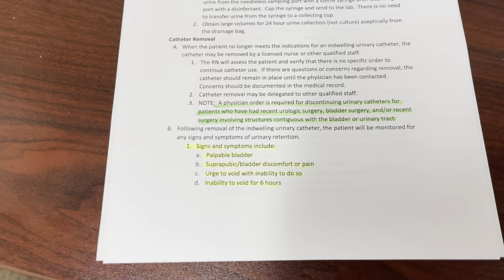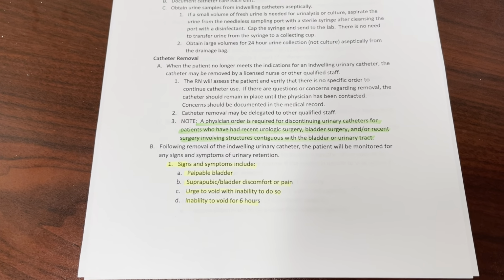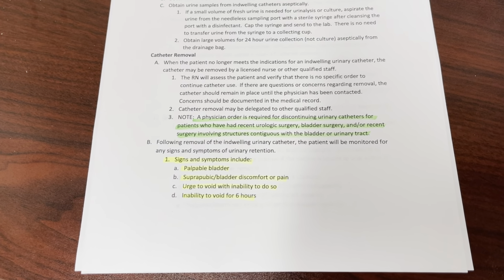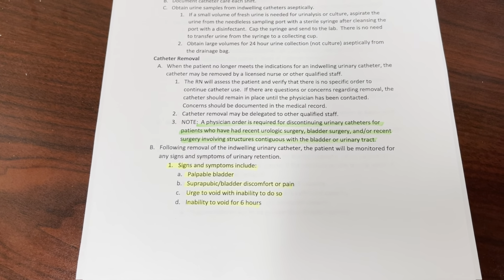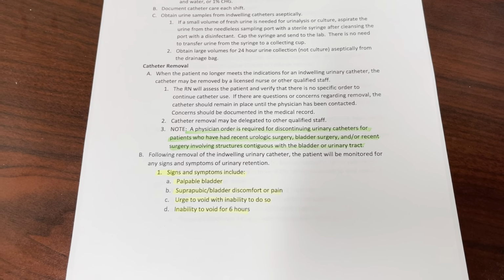For catheter removal, we have to have a valid reason for having a catheter maintained within the patient. We need to be able to speak to that every shift, every day, anytime we go to rounds. We need to be able to speak to it while we have all of our lines in.